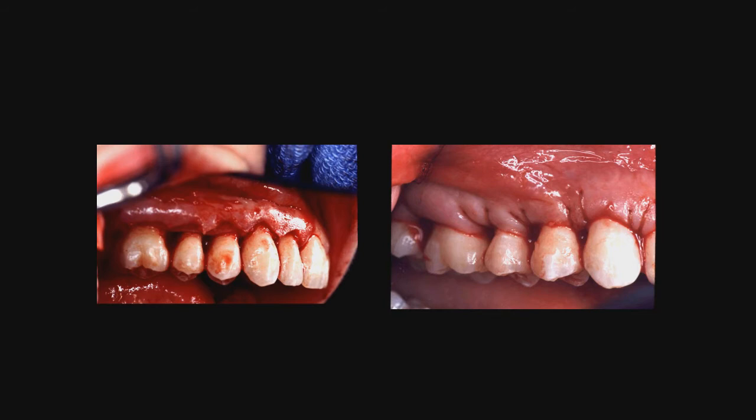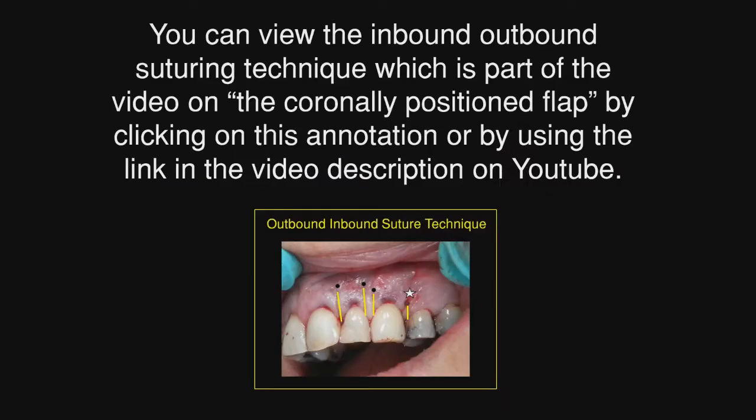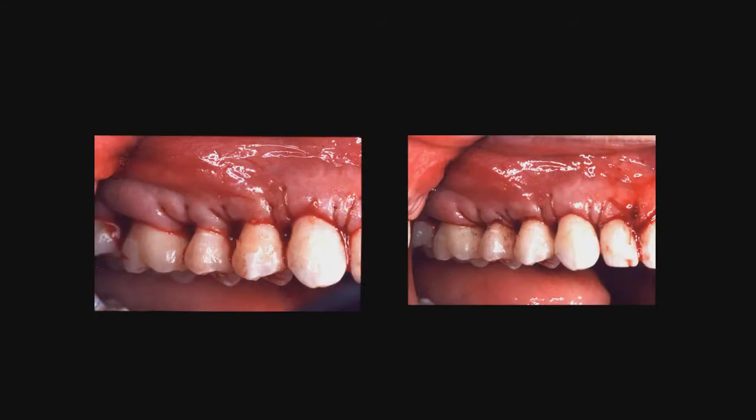So this is after we have elevated the flap before we've done the osseous surgery, and we will actually go into the technique on how to do that in the next case. You'll notice the sutures are a double suture, and you can see how much we have crown lengthened and how much enamel we've exposed. Those sutures, you can view the inbound-outbound suturing technique, which is part of the video on the coronally positioned flap, by clicking on this annotation or by using the link in the video description on YouTube.